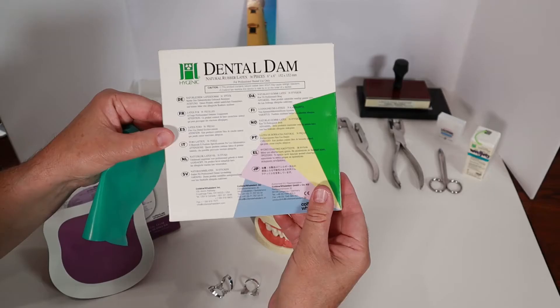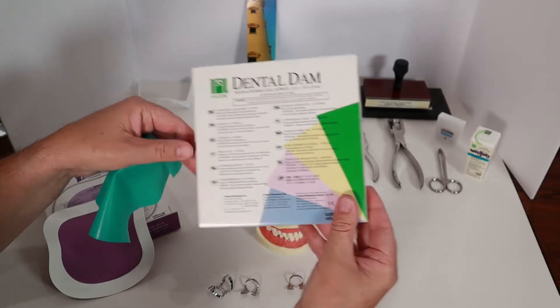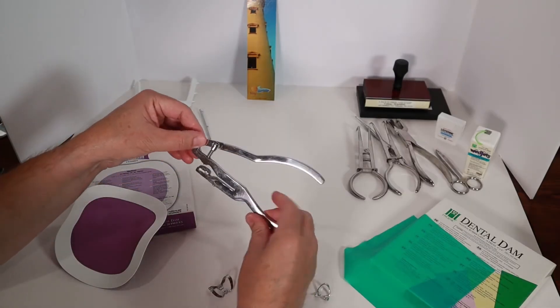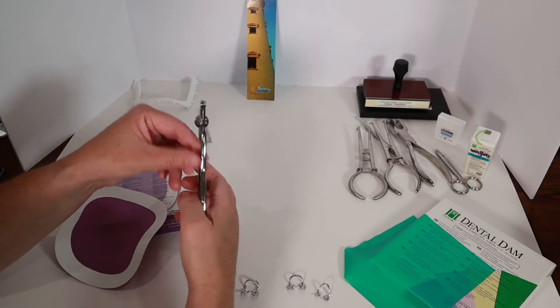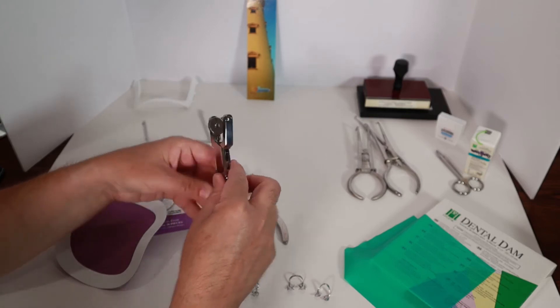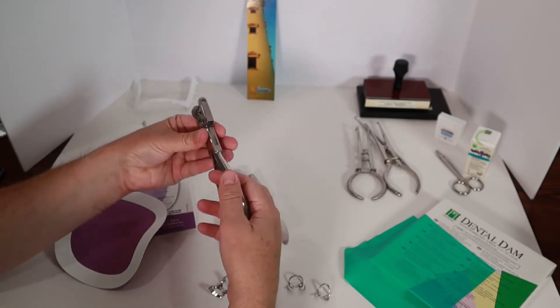Dentists call their tools instruments. The rubber dams come packed in boxes. This tool is the rubber dam hole punch. I use this to punch a small hole or holes in the rubber dam. I have two different styles of punches — they look different, but they both do the same job. The holes are where the teeth fit through.